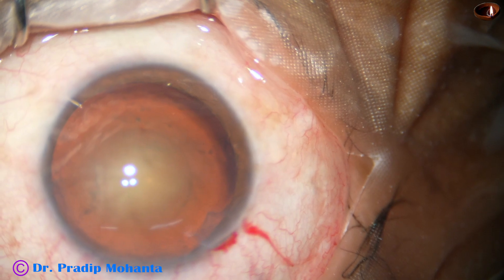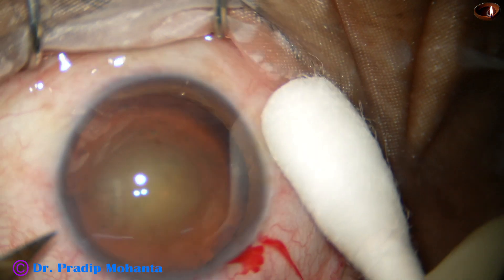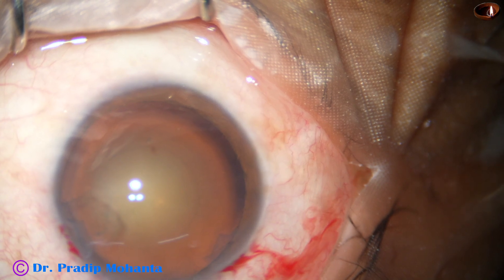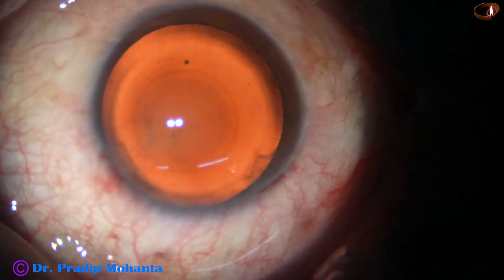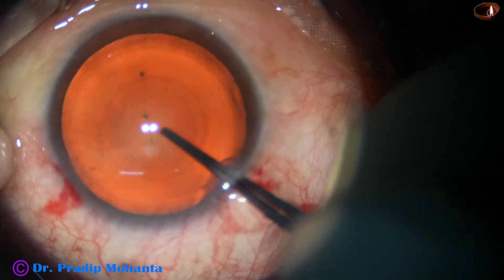Now the anterior chamber is filled up with 2% hydroxypropylmethylcellulose. Then I make a sideport about 90 degrees away from the main incision, because if the sideport is 90 degrees away from the main wound, it will neutralize some amount of astigmatism induced by the main wound.